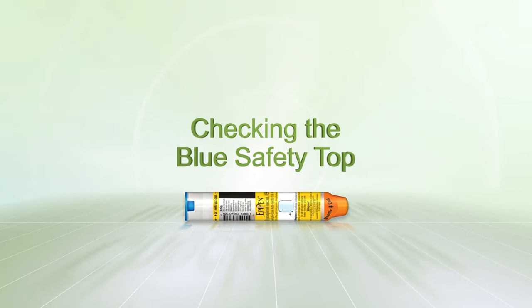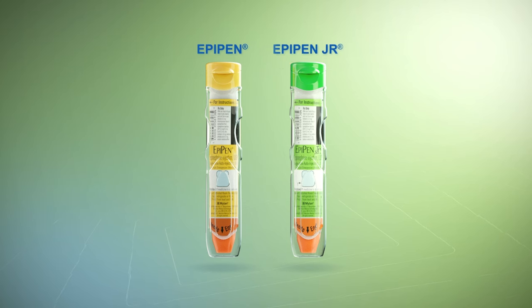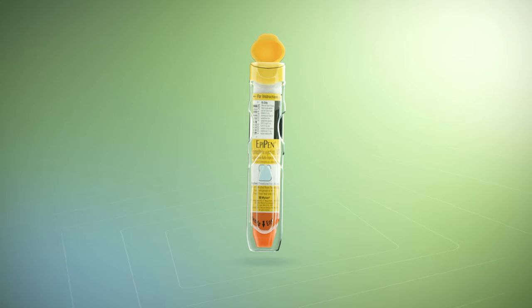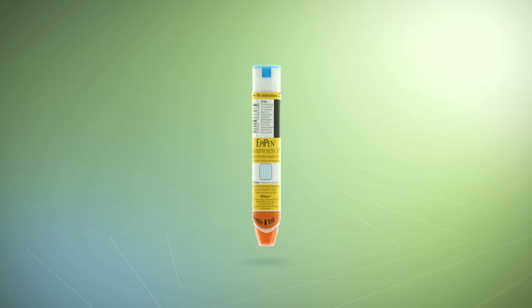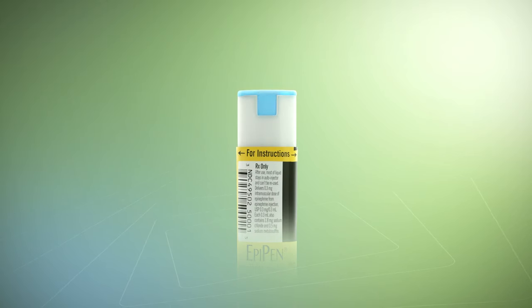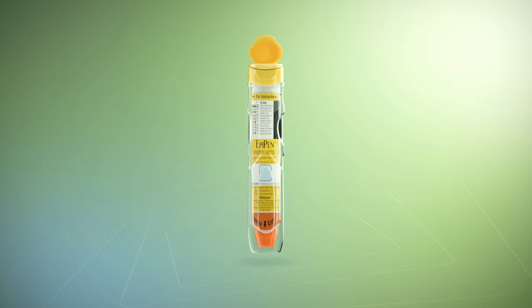Checking the blue safety top. When receiving an EpiPen or EpiPen Jr. auto-injector, and before you need to use it, remove the auto-injector from the protective case and check to make sure the blue safety top is not raised. If the blue safety top is not raised, the auto-injector is okay to use. Put it back in the protective case so that it is ready for an allergic emergency.